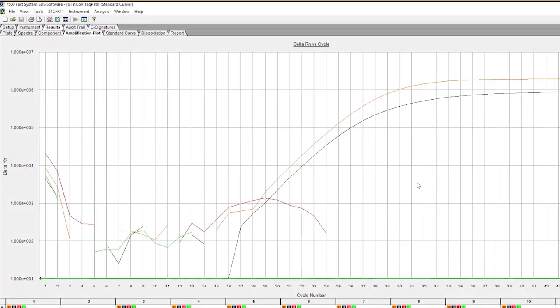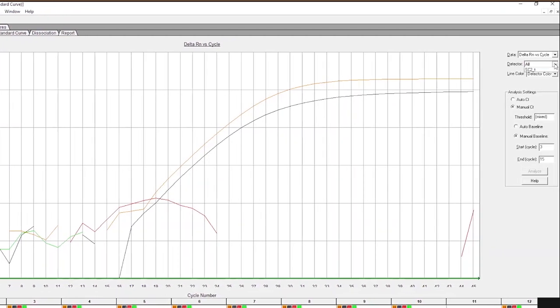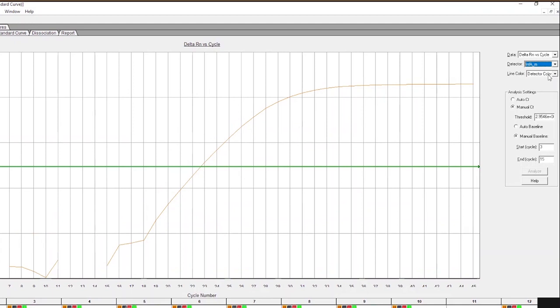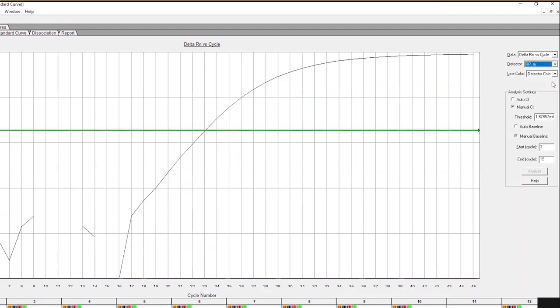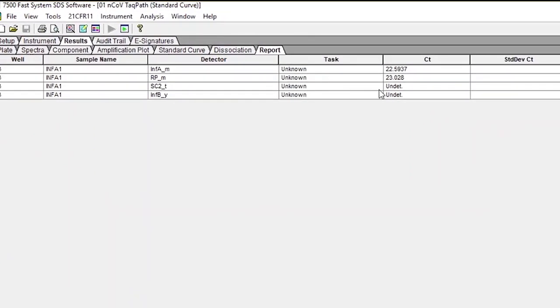When all controls exhibit the expected results and one or more of the viral targets — influenza A, influenza B, and/or SARS-CoV-2 — cross the threshold line before a CT of 40.00, then the specimen is considered positive for that virus or viruses. Multiple viruses may be detected in a single specimen.